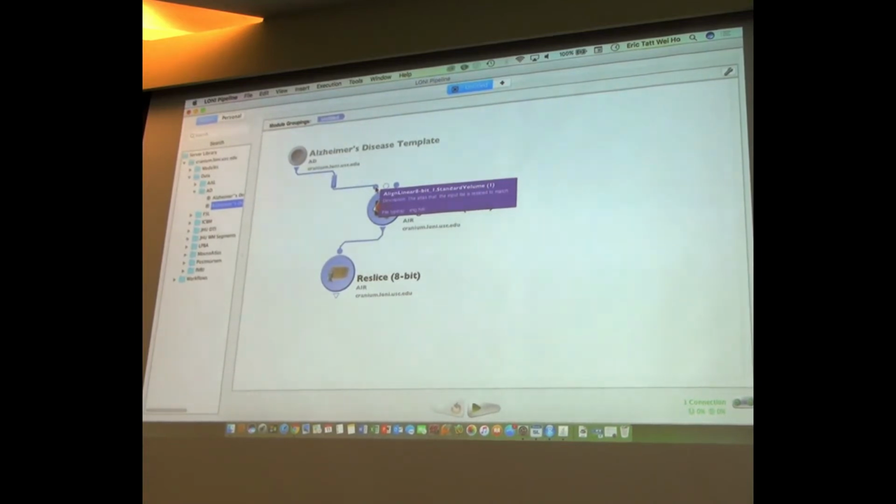Remember I told you about these conversions. So it puts in a smart line. If you don't want this smart line, you can always disable it and pipe the raw data without any manipulation downstream. Okay? That's an option. Now, that's the target. I'll show you in a second what it looks like. This is the target of this registration.